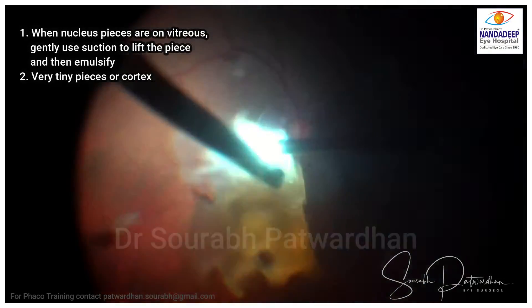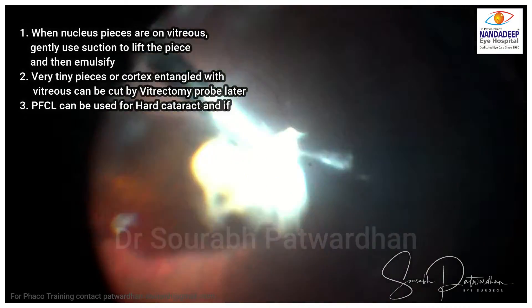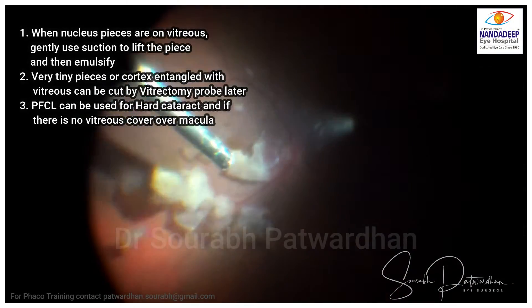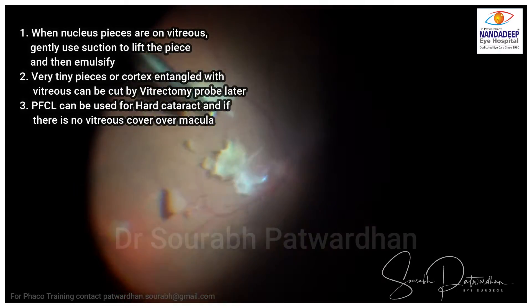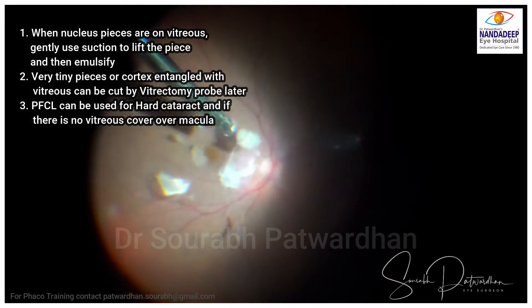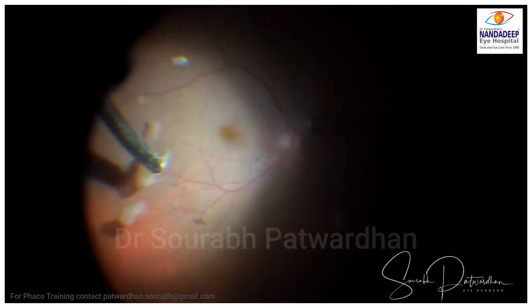Whenever pieces are on the vitreous, gently use suction to lift the piece off the vitreous and then emulsify. Very tiny pieces entangled with vitreous can be cut by the vitrectomy probe later. Don't go too close to the retina, and always use PFCL if you have any doubt that your maneuvers can endanger the macula.